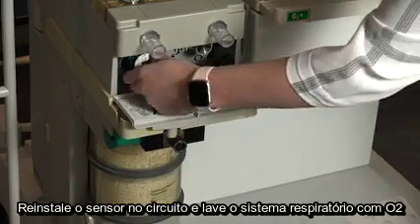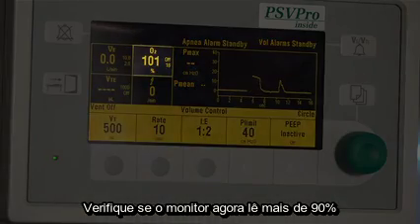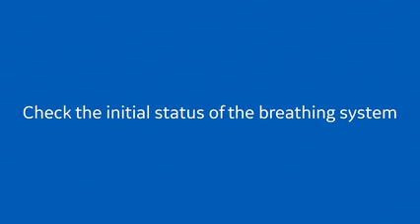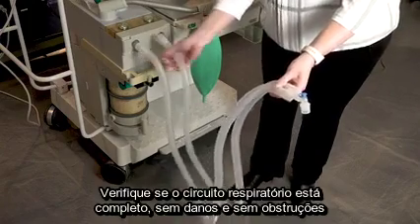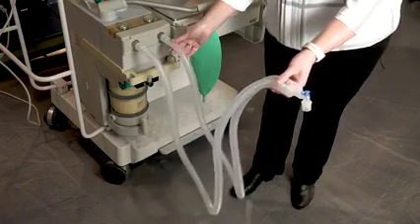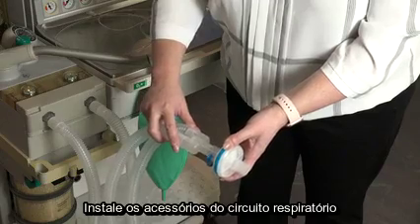Reinstall the sensor in the circuit and flush the breathing system with O2. Verify that the monitor now reads greater than 90%. Check the initial status of the breathing system. Set the selector switch to bag mode. Check that the breathing circuit is complete, undamaged, and free of obstruction. Verify that the CO2 absorbent is adequate. Install breathing circuit accessories.